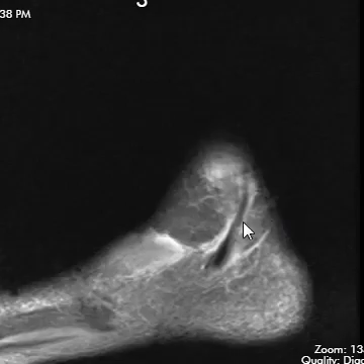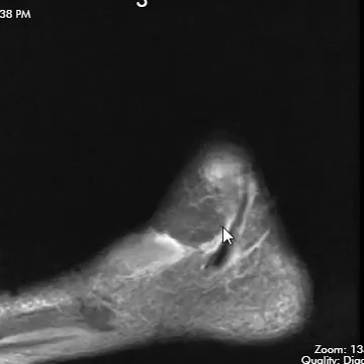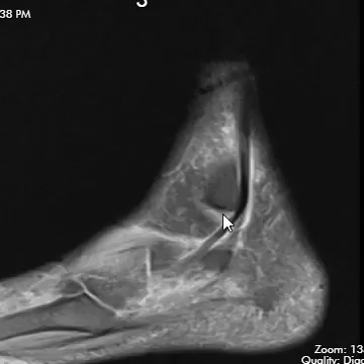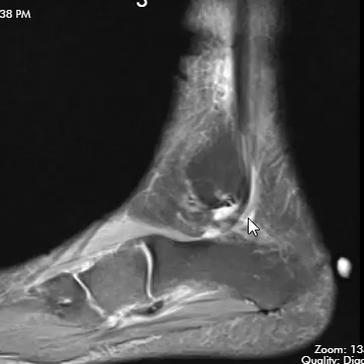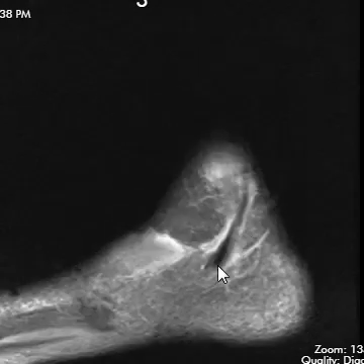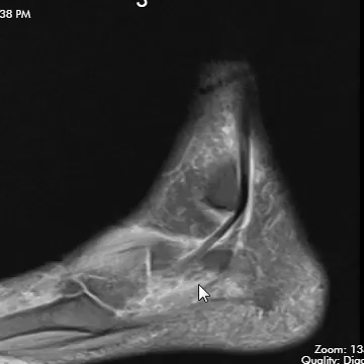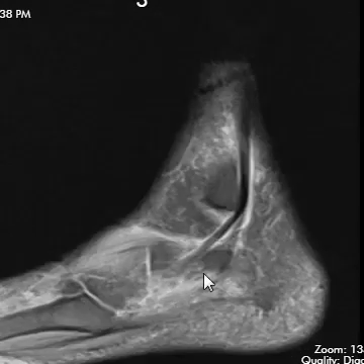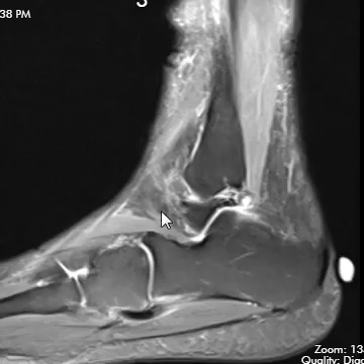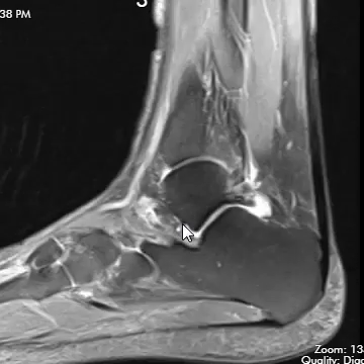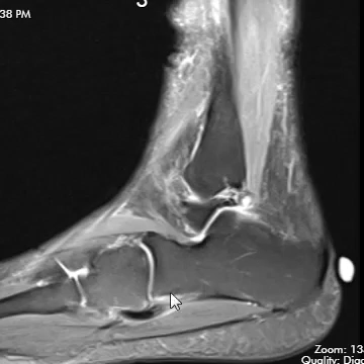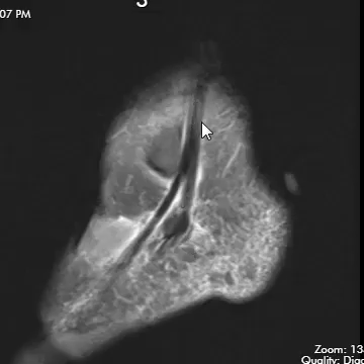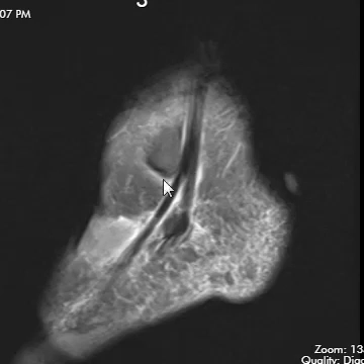This is the fat-suppressed PD image on the same angle of the foot. We can see the peroneus brevis coming down and then disappearing. The peroneus longus comes down, makes that loop, and then between here and here is just invisible — completely absent. This is the foot with the toes pointing up in dorsiflexion, so now we're going to do plantar flexion.